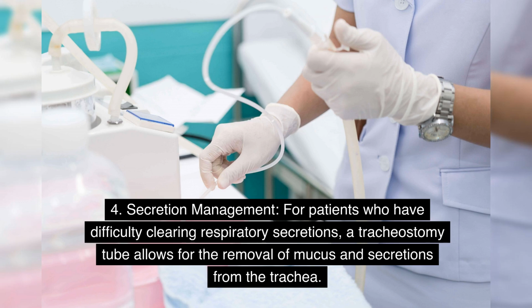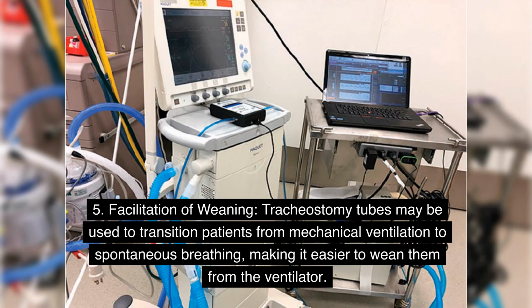4. Secretion management. For patients who have difficulty clearing respiratory secretions, a tracheostomy tube allows for the removal of mucus and secretions from the trachea. 5. Facilitation of weaning. Tracheostomy tubes may be used to transition patients from mechanical ventilation to spontaneous breathing, making it easier to wean them from the ventilator.